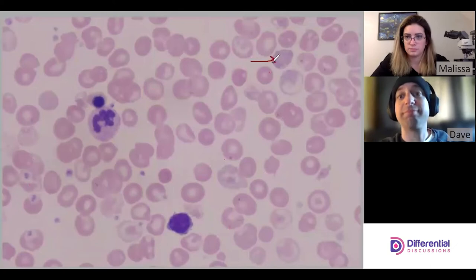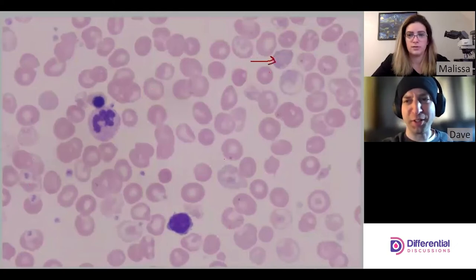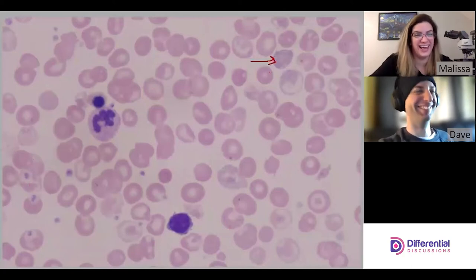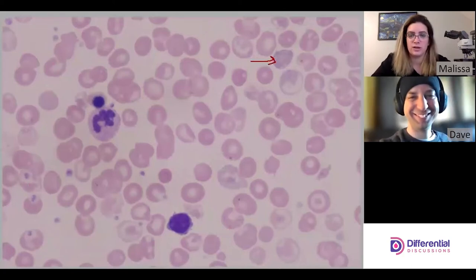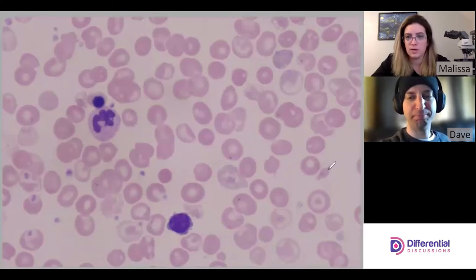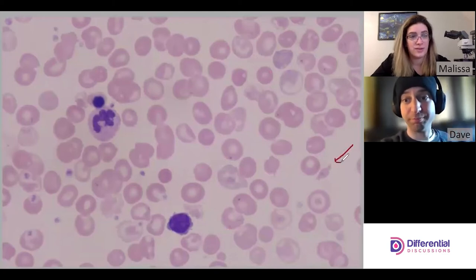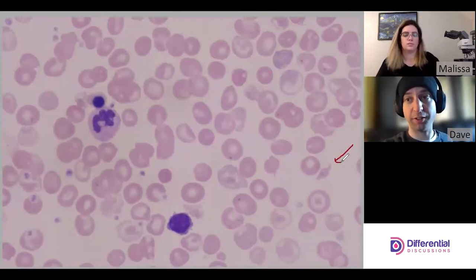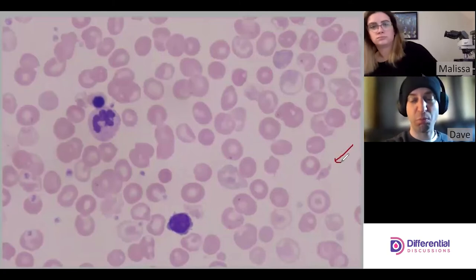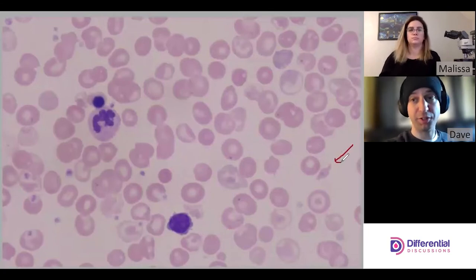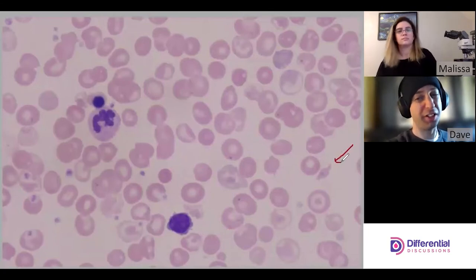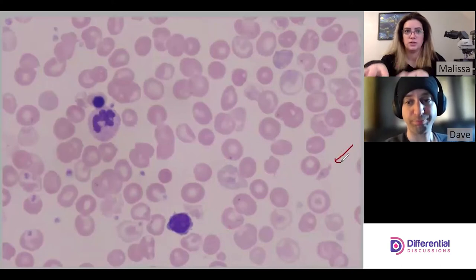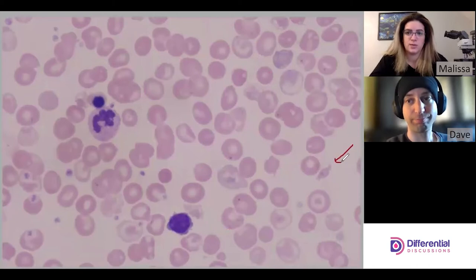This field just keeps giving — we're not even through all the morphology yet. We've got polychromasia, which are those stress reticulocytes coming out. And then there's a schistocyte — a cell fragment. One of the problems with thalassemia is the unused globin chains damage the red cell membrane, causing increased fragility and more schistocytes. This patient probably has a lot more schistocytes as we move around the slide.